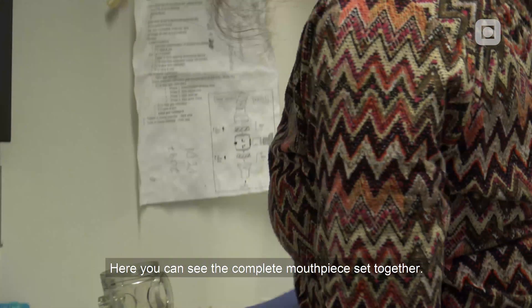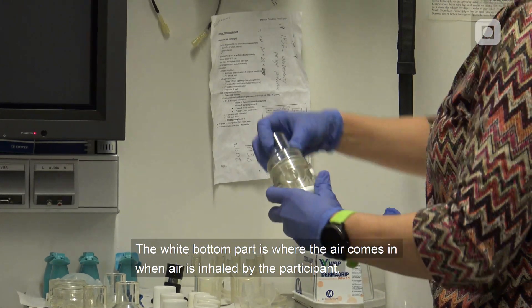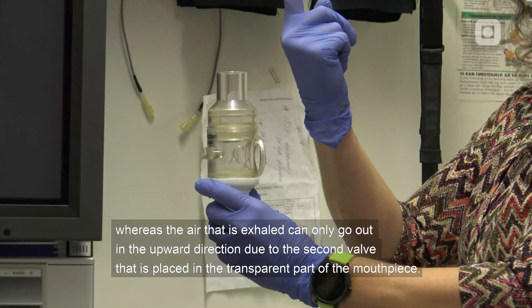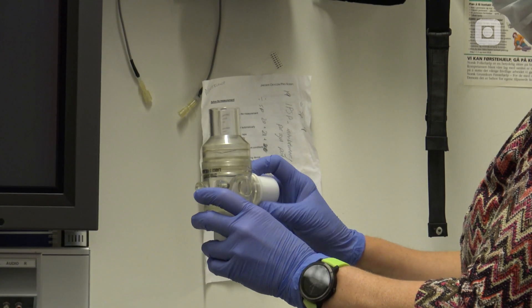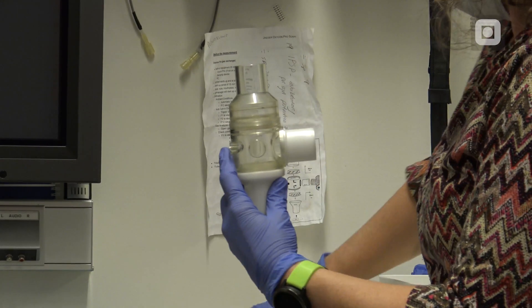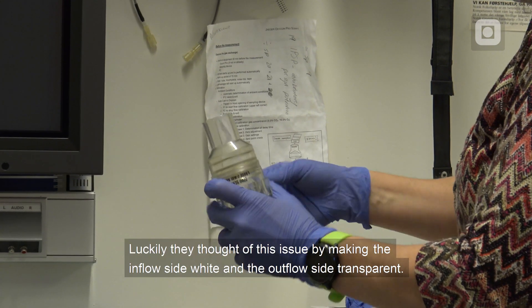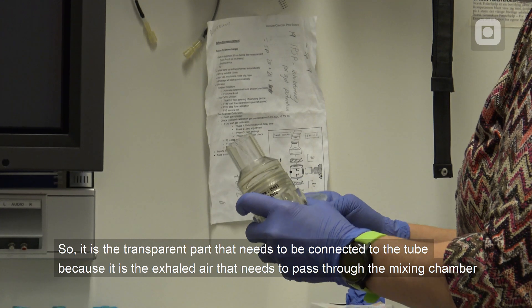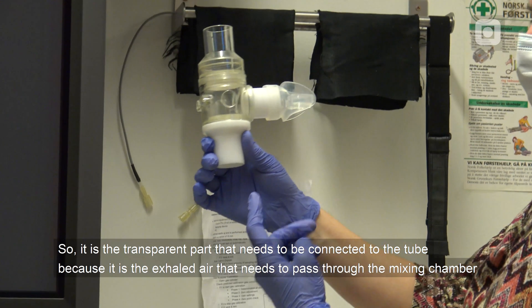Here you can see the complete mouthpiece assembled. The white bottom part is where the air comes in when inhaled by the participant, whereas the exhaled air can only go out in an upward direction due to the second valve placed in the transparent part of the mouthpiece. The whole mouthpiece is then coupled to the tube connecting to the Jäger equipment. The inflow side is white and the outflow side is transparent, so it is the transparent part that needs to be connected to the tube, because it is the exhaled air that needs to pass through the mixing chamber.